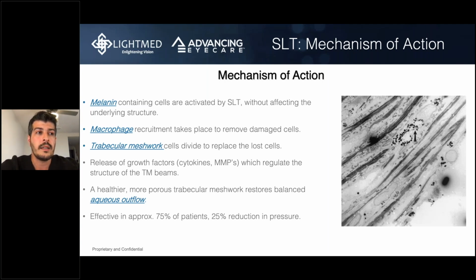I will also say that there's been 2 major studies. One showed that I think they had 40 or 50 eyes. Half of them got steroids after SLT, half of them didn't get steroids after SLT, and both did well. Both had no or minimal risk of IOP spike, and you looked at their IOP 6 weeks or a few months after, it was the same.